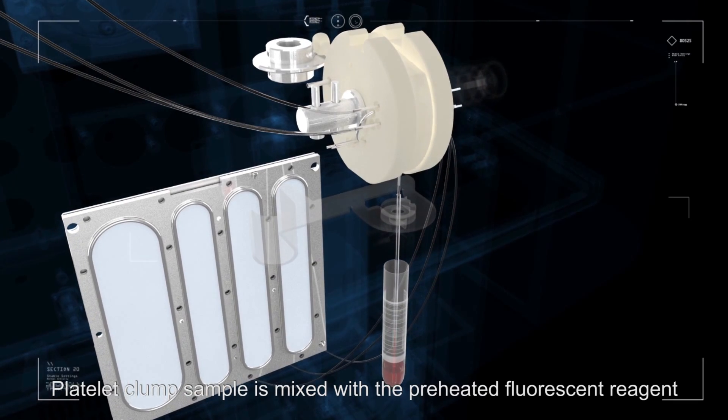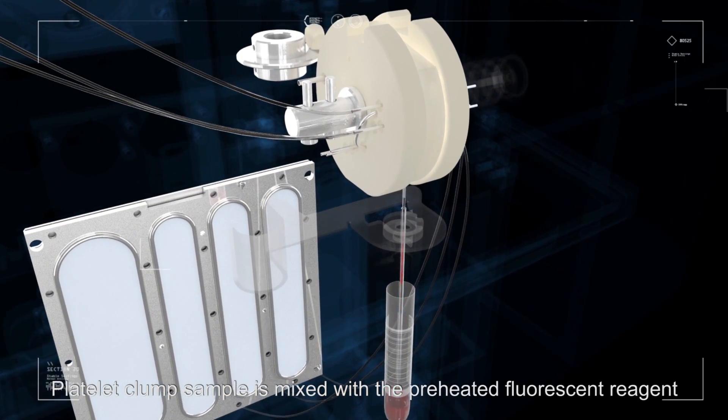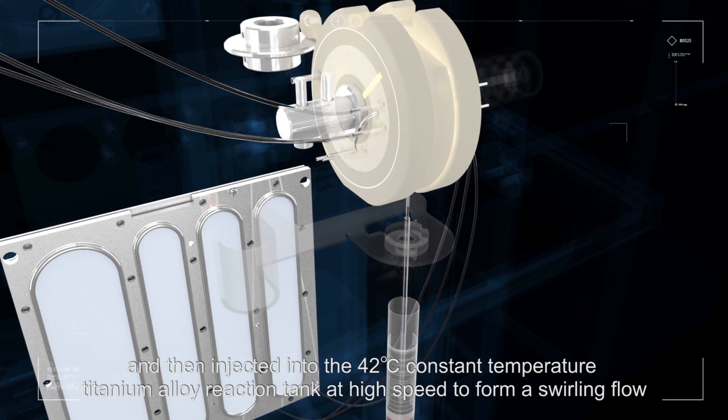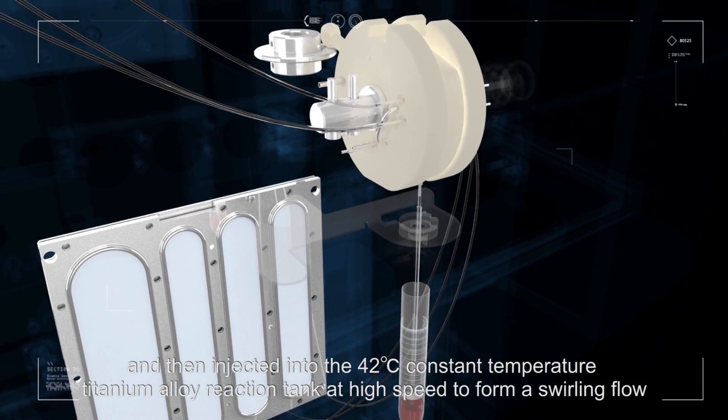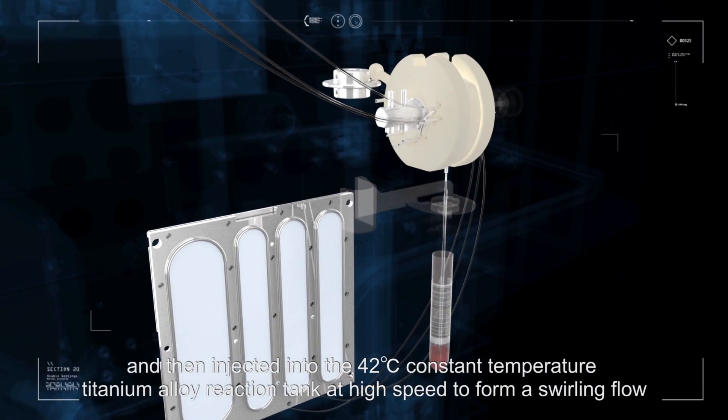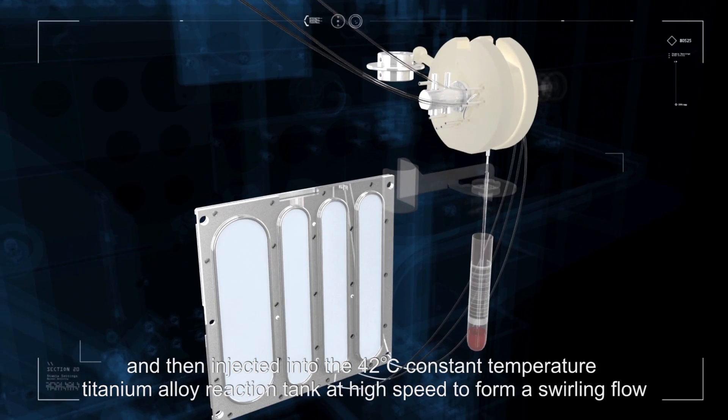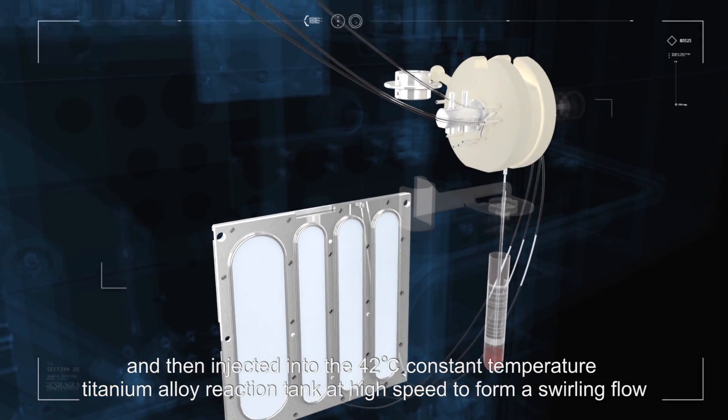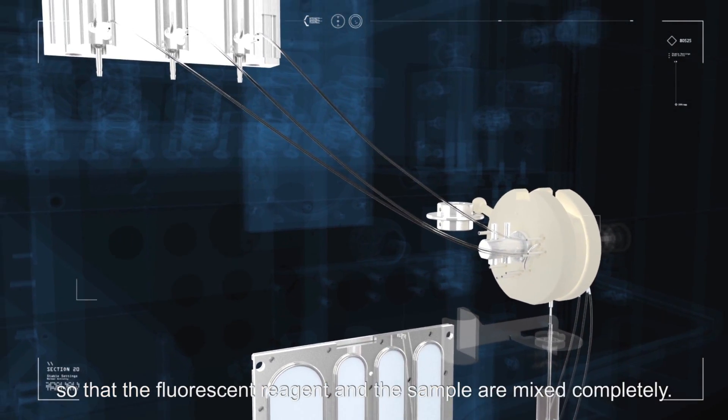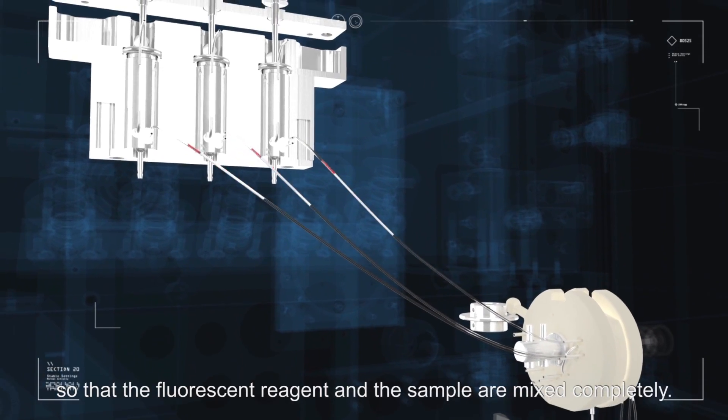Platelet clump sample is mixed with the preheated fluorescent reagent and then injected into the 42 degree Celsius constant temperature titanium alloy reaction tank at high speed to form a swirling flow so that the fluorescent reagent and the sample are mixed completely.